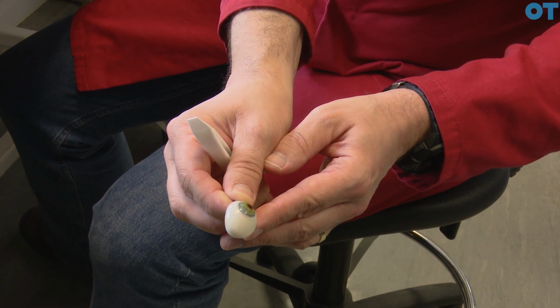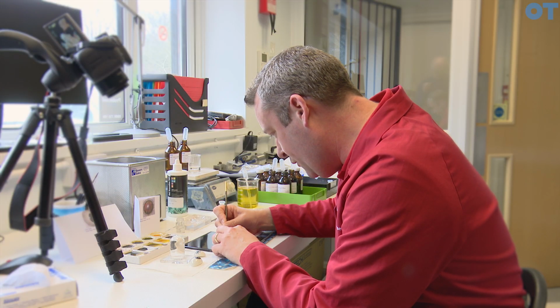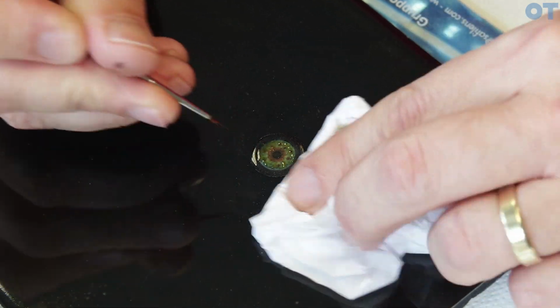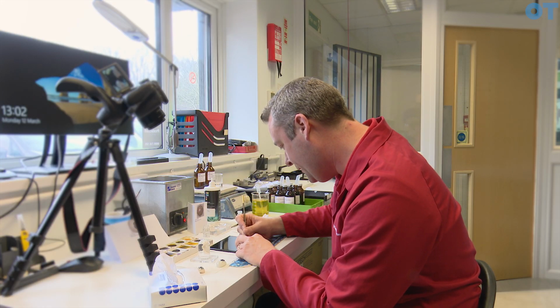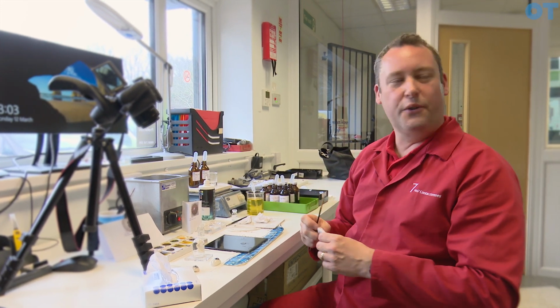So now with this one, it's got to the stage where it'll probably have to go into the oven. It goes in the oven, then I just tweak it a little bit, tweak the colour as to however it's changed whilst being heated at temperature. This is actually quite an unusual one to do. Not all the eyes you paint are this sort of bright green with brown speckles.